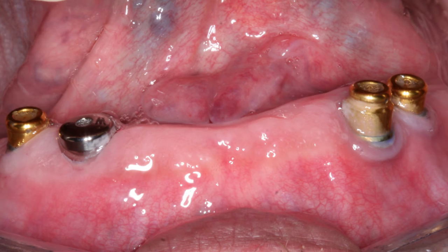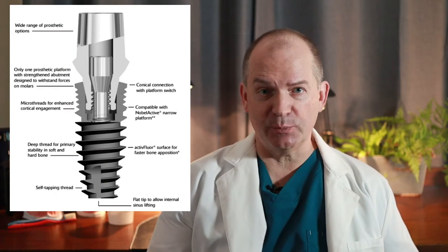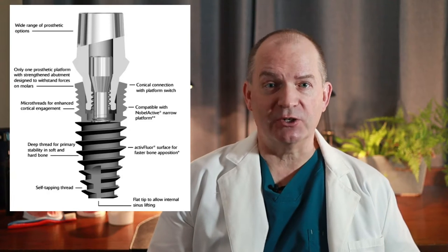In your mouth, you want to brush around the dental implant posts that stick up through your gums. You will collect plaque and tartar on them, so it's important to keep them clean. Since the implant posts and the dental implants themselves are made out of metal, you won't get cavities, but you can get gum disease around dental implants. Gum disease around dental implants, called peri-implantitis, can lead to the implants failing. So that pretty much covers what maintenance you can do at home.